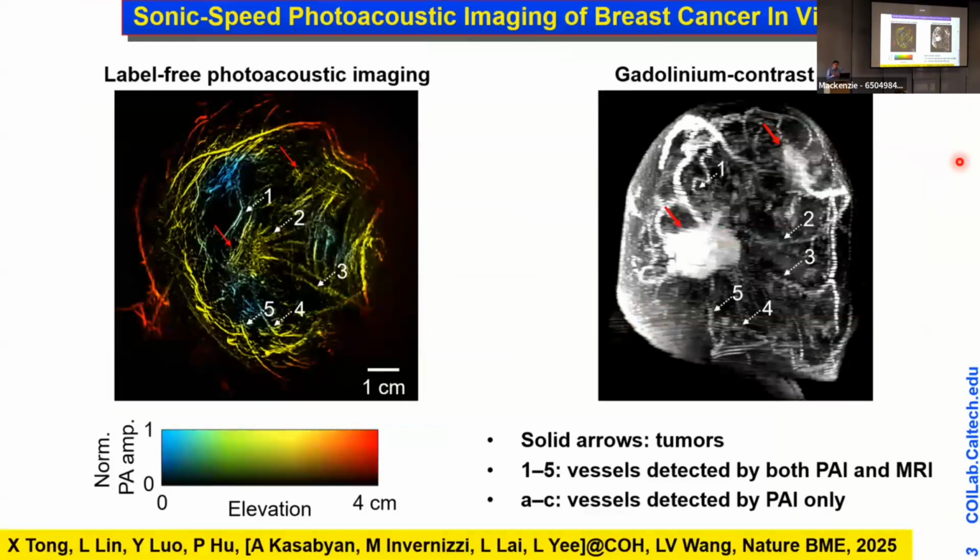Our lab has been working on photoacoustic tomography for a few decades now. This technology has been commercialized. The beauty is that we break through the so-called optical diffusion limit, because standard optical imaging has problems with scattering, multiple scattering beyond one transport mean free path. It's very hard to achieve very high resolution. So we use diffuse photons combined with acoustic signals induced by the photoacoustic effect. We can achieve much higher resolution. So on a per dimension basis, we can resolve more than 100 pixels.